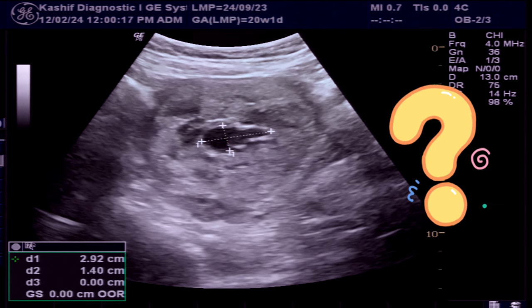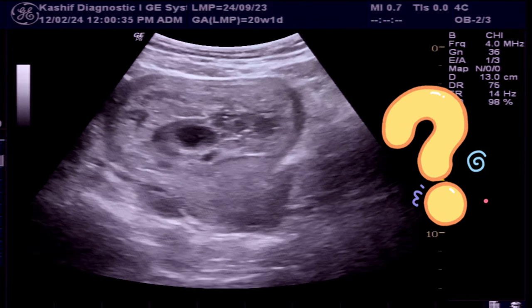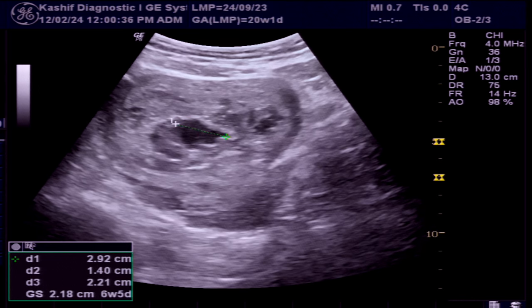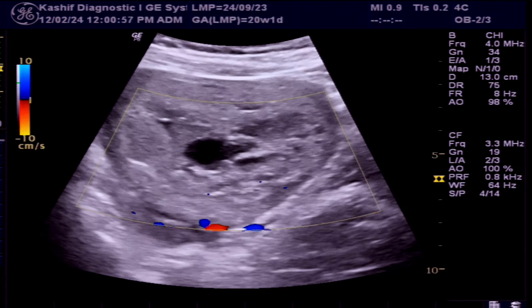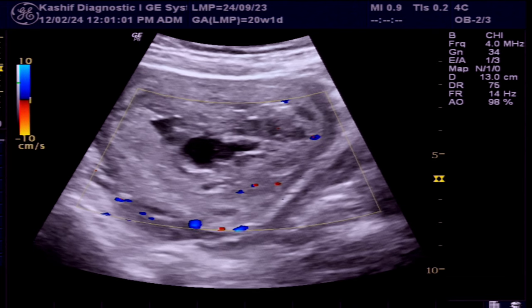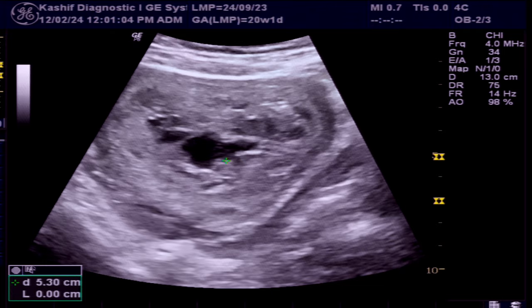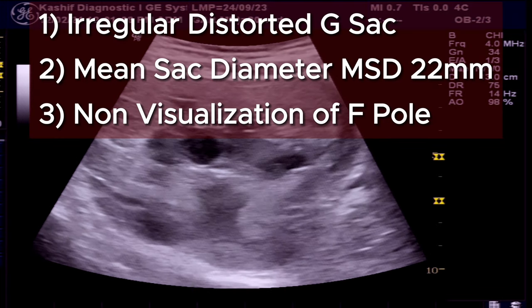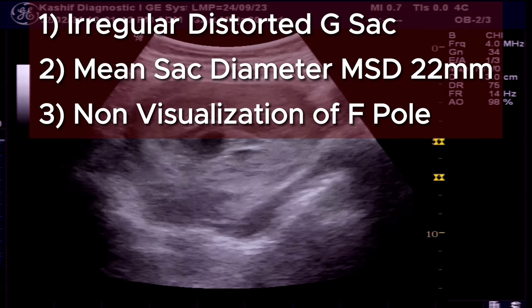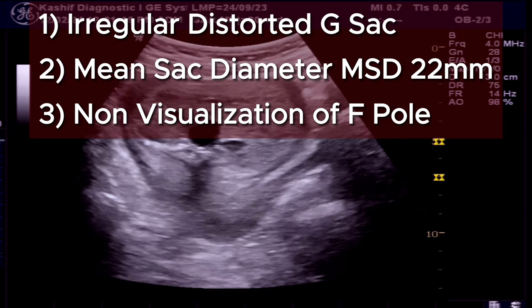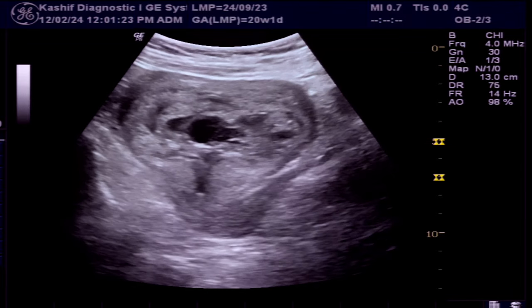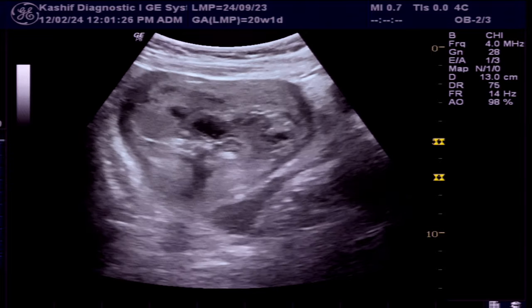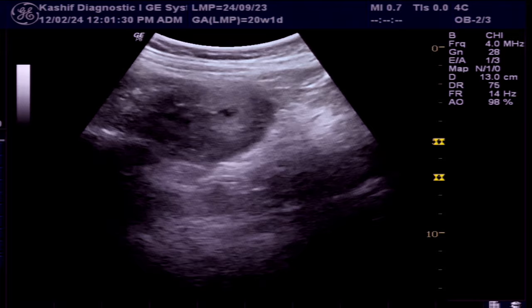The most important question is: what to do now? The gestational sac shape is very important — it is irregular and distorted, and no fetal pole is visualized. The fetal pole and cardiac activity are normally visualized at 5 weeks and 4 days. Although the patient is unsure of dates, the irregular and distorted shape of the gestational sac, plus a mean sac diameter of 22 mm and non-visualization of the fetal pole, is diagnostic of miscarriage or missed abortion. There is no need for unnecessary follow-up, which only increases patient stress and wastes time and money.